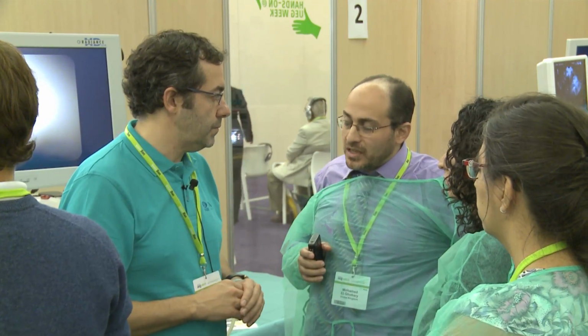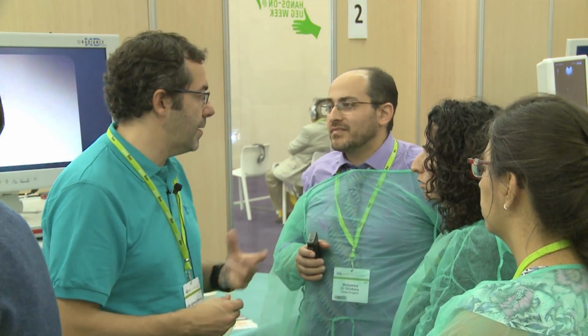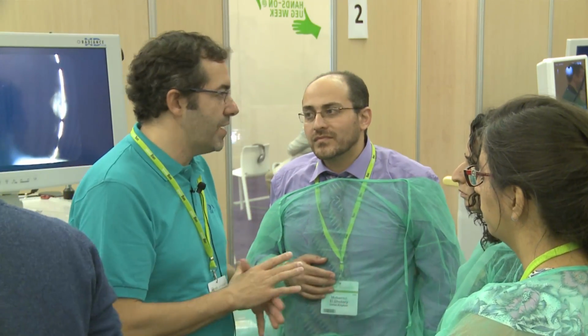Can I use the needle twice in another patient? Never, ever, never. They do something like that in India. Yes, I've discussed this. I was in India this summer in a meeting in Delhi, and I got that question. I think if that happens, the companies need to decrease the cost of the needles in those countries, because it's not acceptable to use the same needle in 2 patients. Of course, if there is no option, either I use the same needle in the same patient, or I will not be able to perform the procedure. Then I would need to sit down, weigh pros and cons, and decide. But in the first world, and it seems that we live in the first world, we should never, ever use the same needle in another patient, ever.